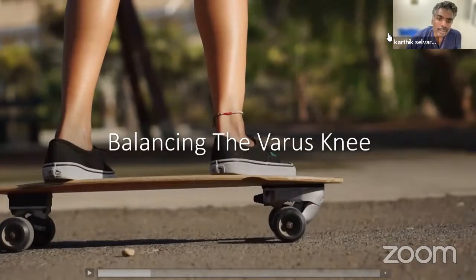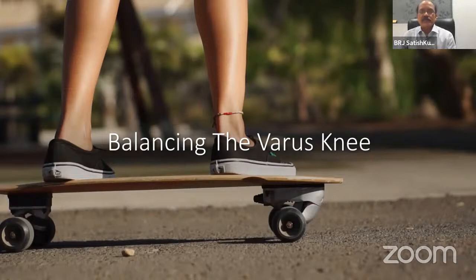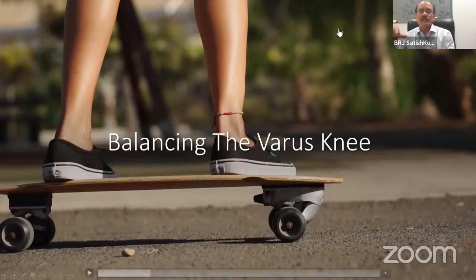Okay. And there is another question. Metaphyseal varus and tibial stem implantation. What are the tips? See, metaphyseal varus, again, how much is the varus? We have to see. If the patient has got what is called a stress fracture and the deformity is more, then you have to do a complete osteotomy there. And then put the tibial implant and use a relatively longer stem. So that the idea is you have to get a good deformity correction.